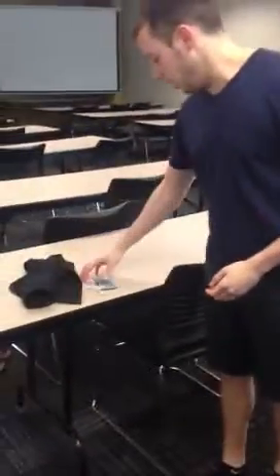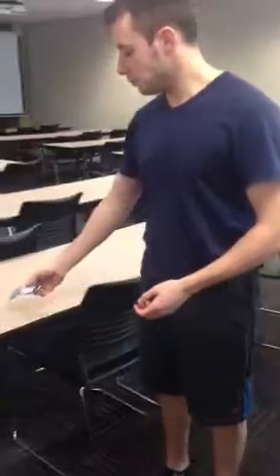So today we're going to be doing an E-stim treatment, interferential or IFC, and premod. First thing you want to do is obtain the right equipment. We have the ultrasound machine or stim machine here, towels for draping, and the electrode pads.